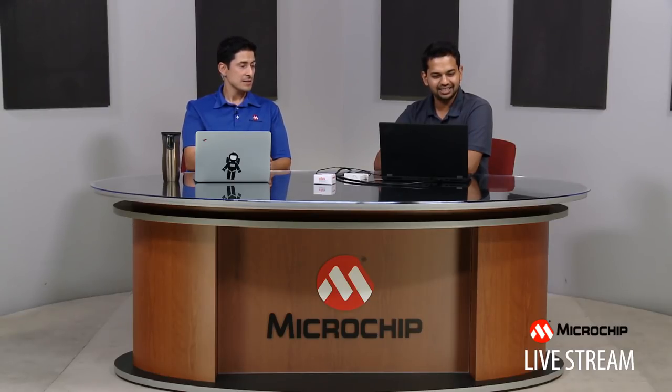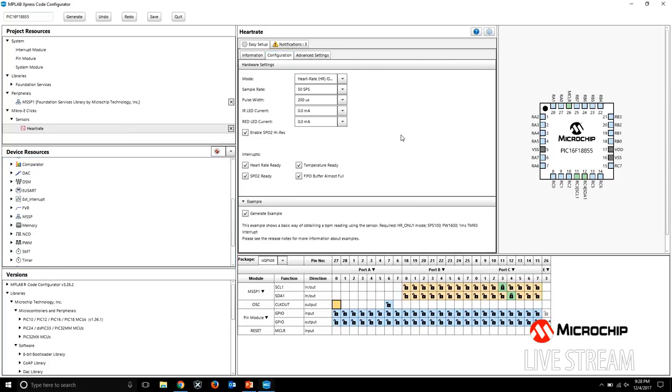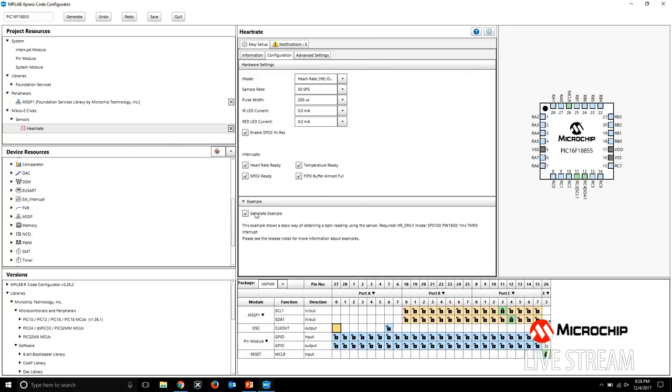All right, so the next step is we're going to set this up. So I'm going to click on configuration. And in configuration, we have some different stuff that we have to configure. But the easiest thing to do here is actually to use the example code that is generated by MCC. So this box is checked by default. And it tells you, if you want to use the generated example that MCC will give you, that will require HR-only mode, a sample rate of 100 samples per second. Those are the parameters they gave us. So I'm just going to follow that.